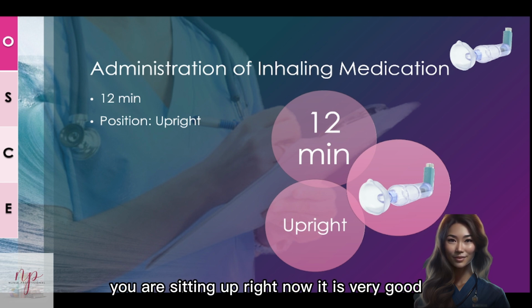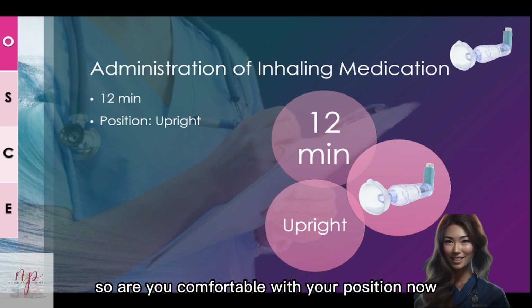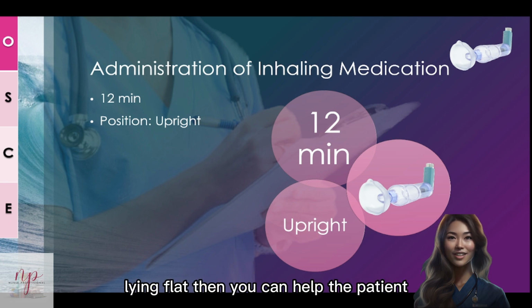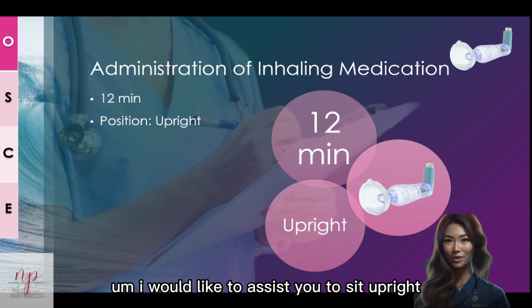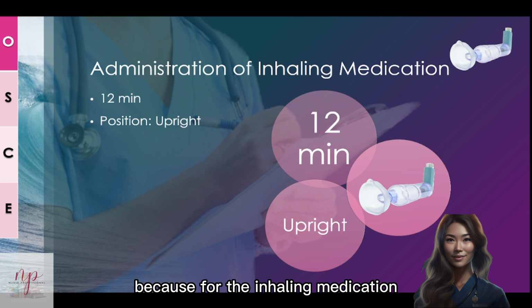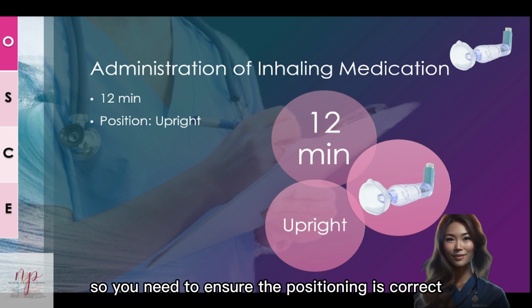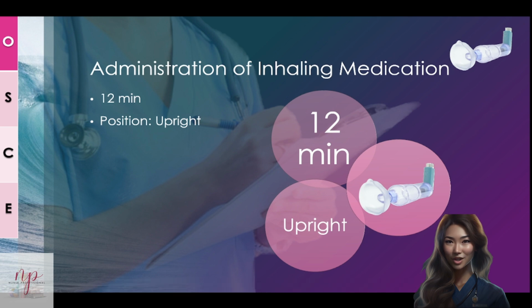You are sitting upright now, it is very good. So are you comfortable with your position now? Something like that. Or if the patient is lying flat on the bed, then you can help the patient. I would like to assist you to sit upright, because for the inhaling medication, you need to sit upright to do it, alright? So you need to ensure the positioning is correct.